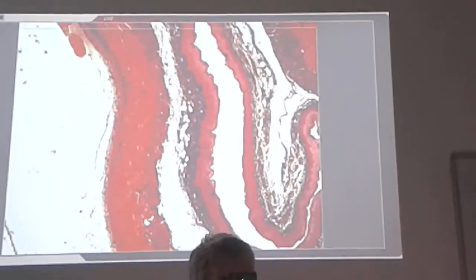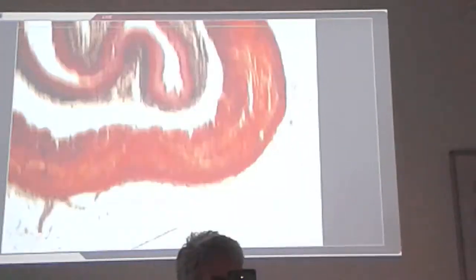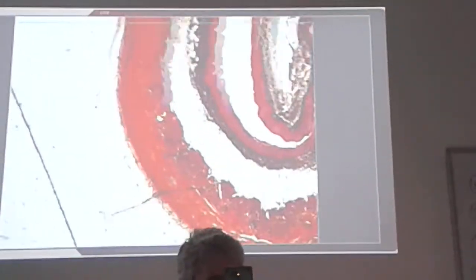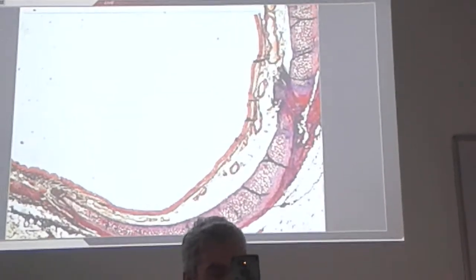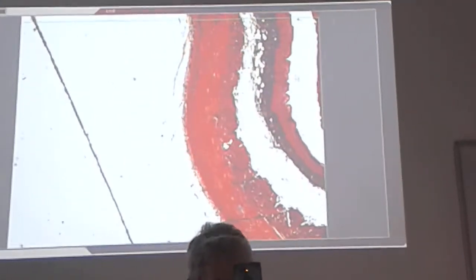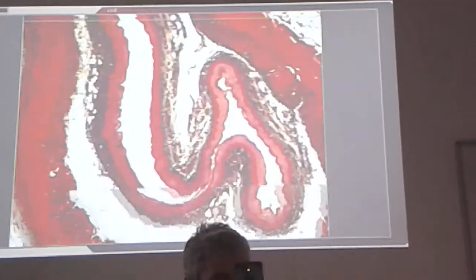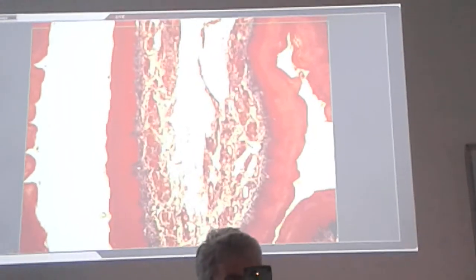So the esophagus lumen is clearly identified by the indentations, let's say some invaginations, and the trachea lumen is very circular and very straight. So we are now interested in the esophagus lumen here. I will also try to introduce you to the layers of the esophagus. It is the same for all the digestive tract.